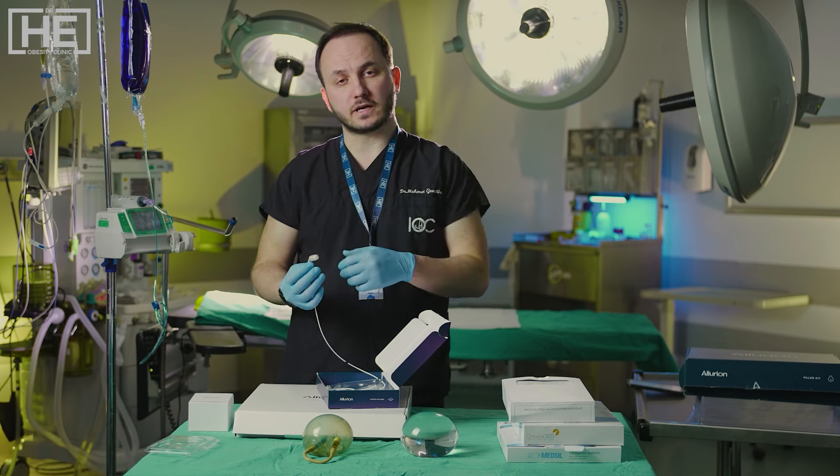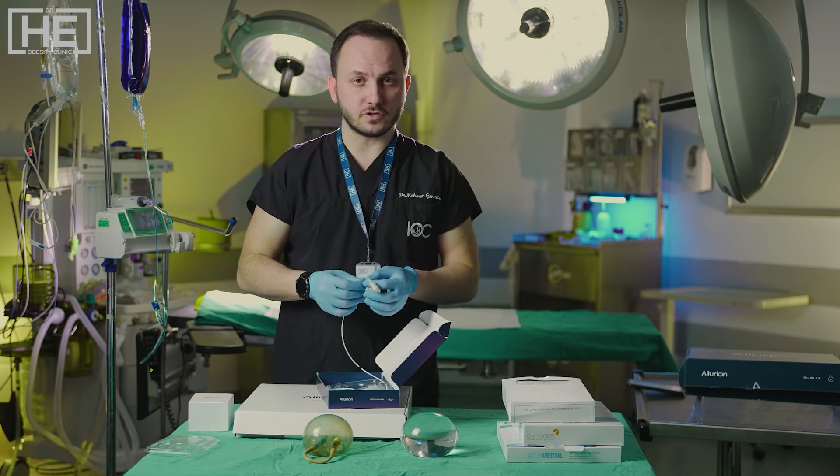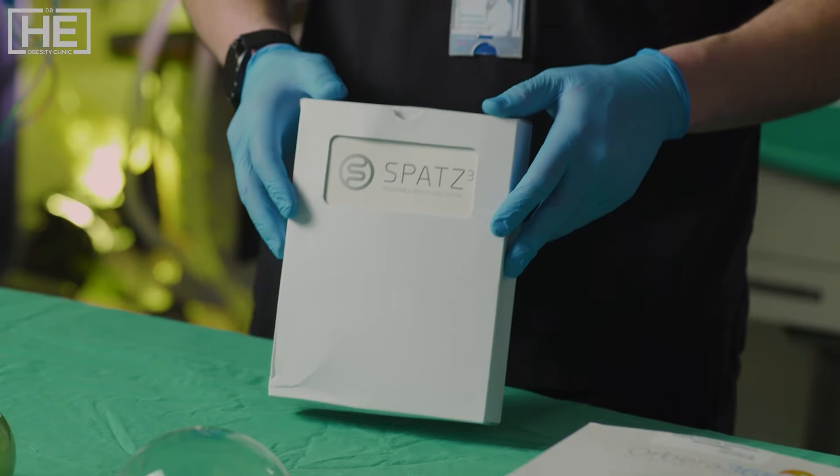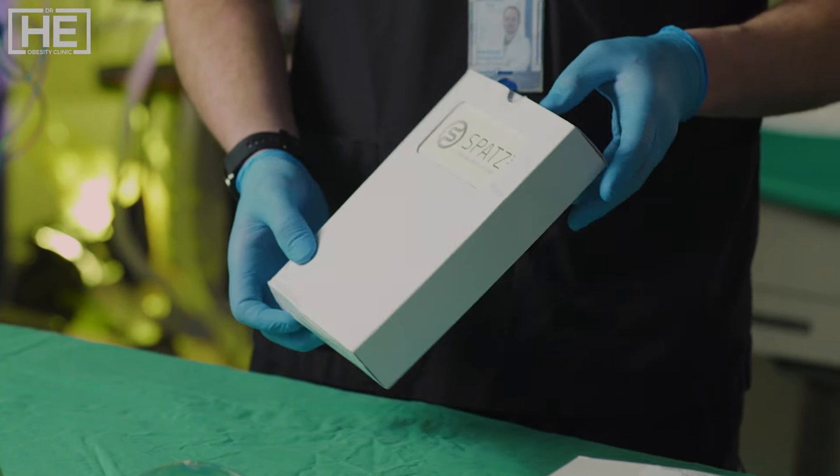Allurion also provides a connected scale and watch for tracking your weight loss process. We recommend this balloon to patients who come from far countries, because as I said, we don't need to remove it — it melts down in four months. The weight loss expectation with this balloon is 10% of your initial weight.